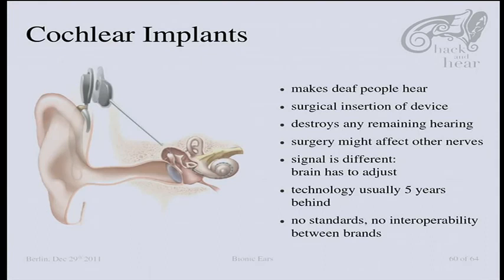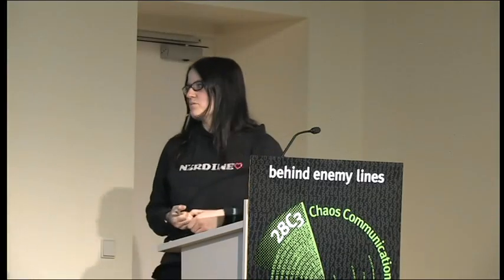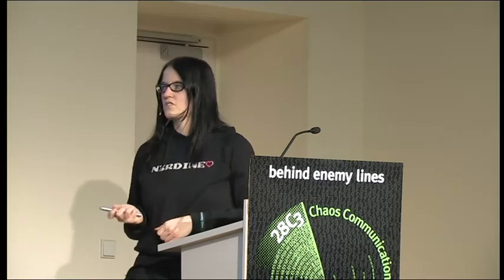It destroys any remaining hearing because, I mean, you poke a wire into the nerve, so everything else is gone then. It can also affect other nerves. So I have a friend who had this surgery and they touched some taste nerves as well. So everything tasted metallic. It was kind of weird, but it actually went away after a while. The signal is really different.